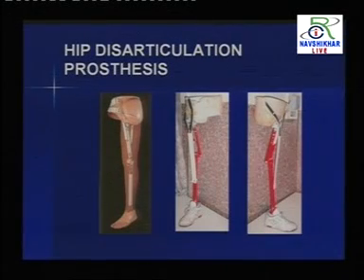सबसे पहले कास्टिंग, जब उसका कास्ट लेते हैं, नेगेटिव इम्प्रेशन लेते हैं पेशेंट का, वहाँ से लेके फाइनल फिटिंग तक, असेंबली करने तक, everything has to be taken care of by the prosthetist, so that the patient should be quite comfortable with that, and weight bearing should be comfortable. First thing is the balancing, and then movement of the joints, then how to move the joints with the help of elastic. You can see the slides. We can put some elastics also. We have fitted an elastic on the anterior side, which helps the extension of the prosthesis. So these elastics actually replace the muscles.